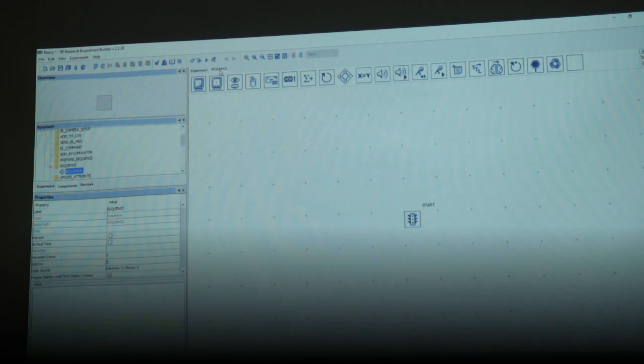So if you can recall the earlier presentations, there you see a dot on the screen, you have to look at the dot, it moves across the screen, you keep looking at those dots in that order, and what an eye tracker does is records your eye movement with reference to the dot. If it aligns with the dot, which means you are looking exactly where you expected to look, the calibration is successful.